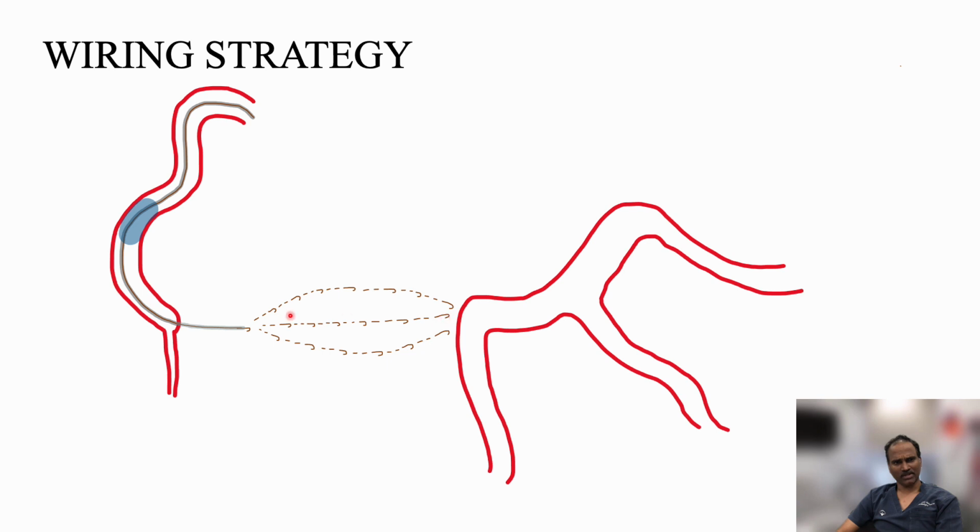And then you advance the microcatheter here and take a directable wire and direct it into the distal vessel. So essentially it is initial escalation of the pilot, and then embed the microcatheter here, and then knuckle to cross the loop, but don't spoil your distal segment before the distal cap.